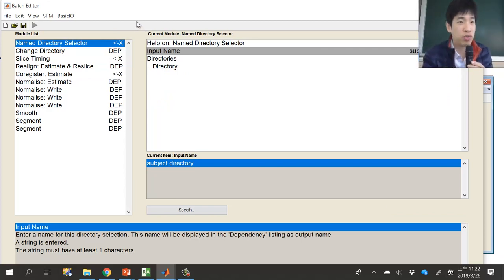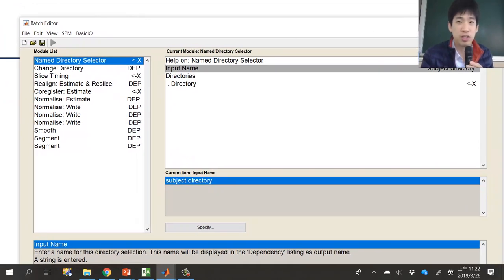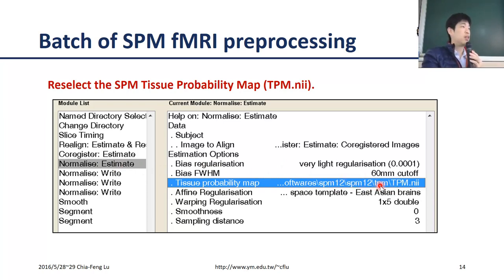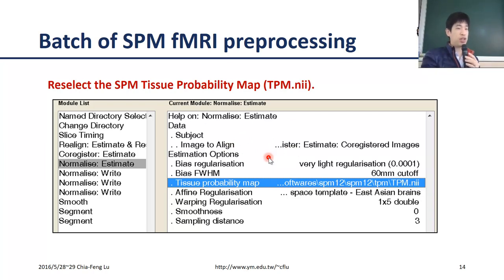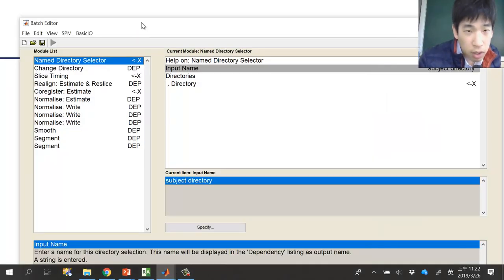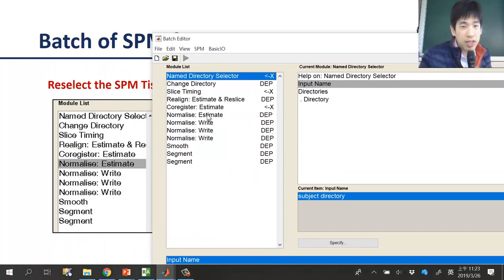Before specifying the files, you need to adjust some settings. The first thing to adjust is the file path, because the file path in this batch is set to my desktop PC, not yours. Before doing anything, you need to modify the batch file so it matches the file path on your own notebook or desktop PC. Go to the Normalize Estimate step and click on it.